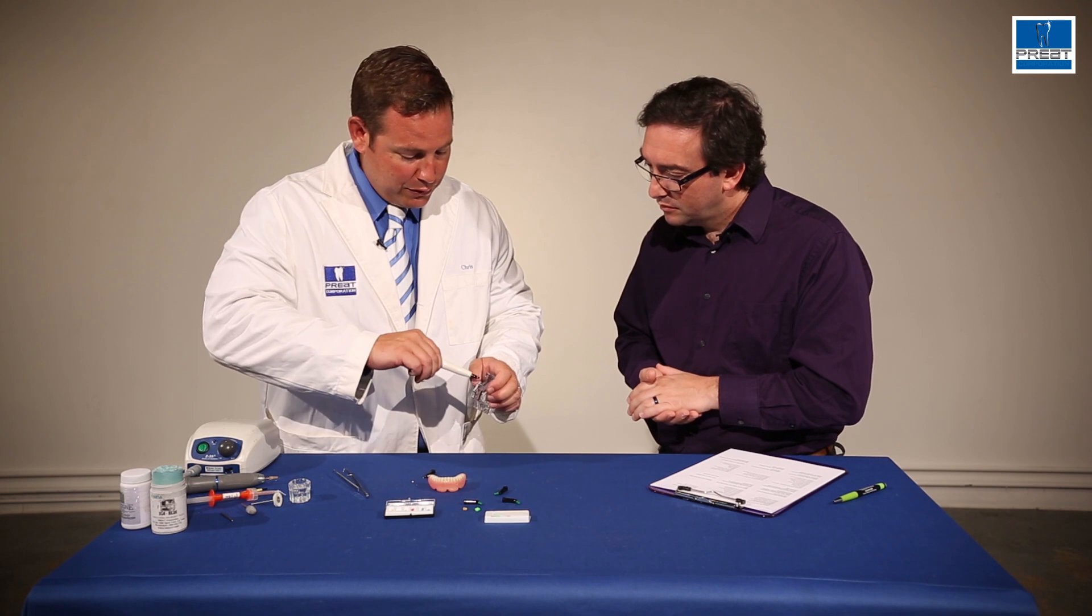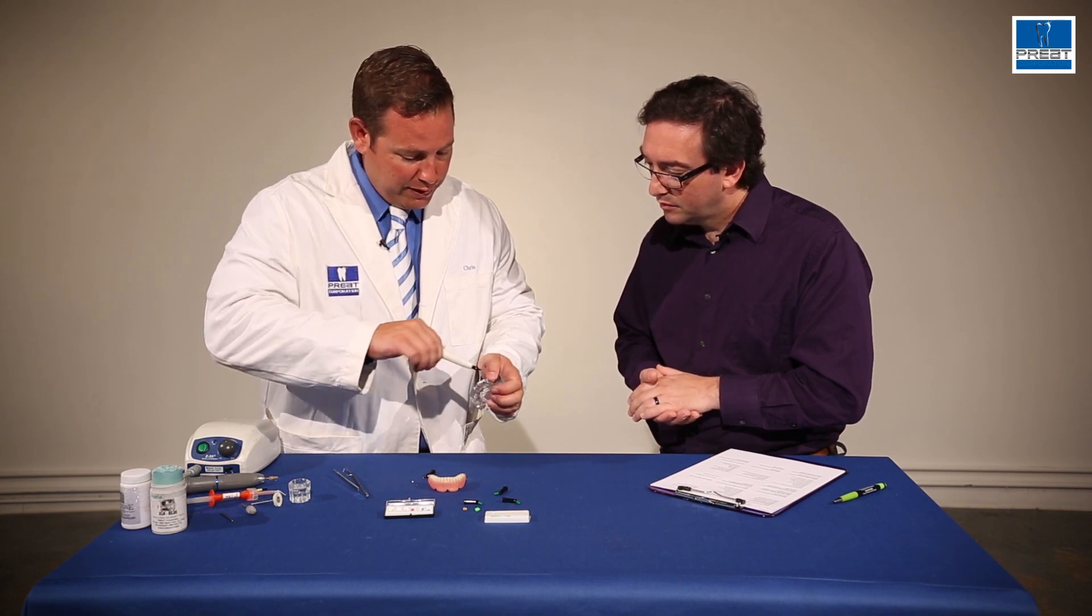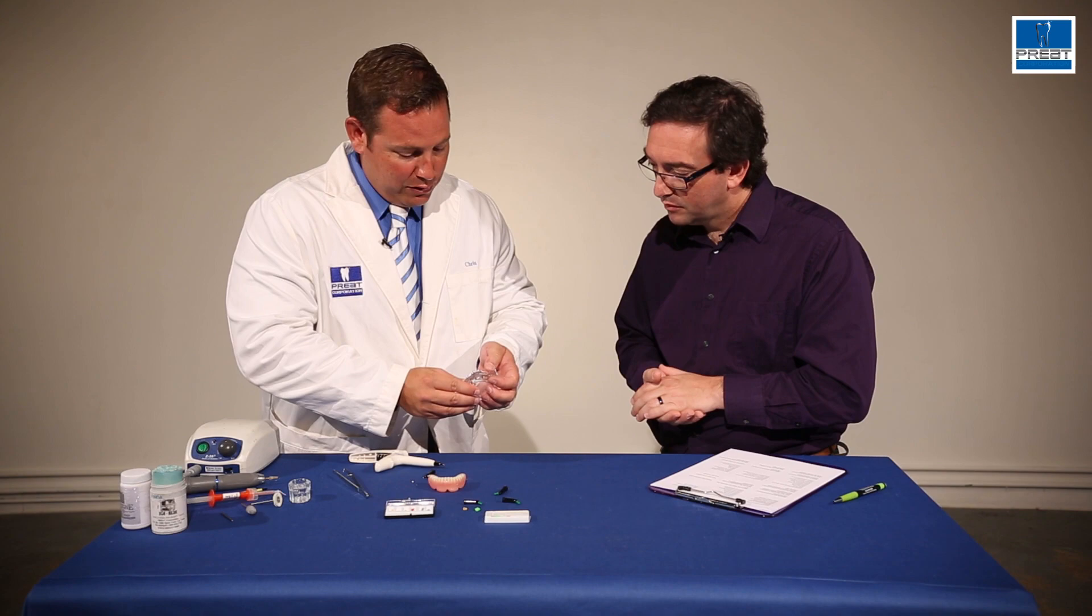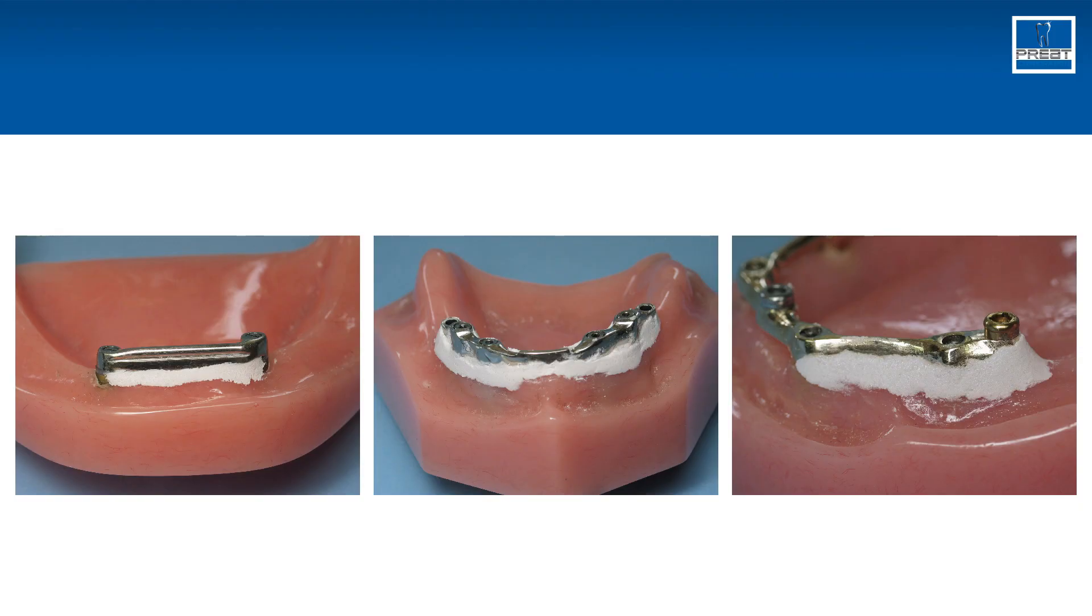And this doesn't need time to set or anything else? No. Once you express it out, it's good to go. And just in case we get any excess acrylic back here, the blockout procedure is definitely better safe than sorry.